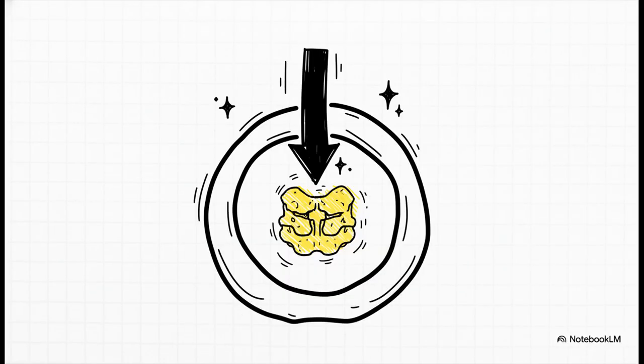So, the crucial point is this. When a radiographer executes the Townes method perfectly, aiming that 30-degree caudad beam right through the top of the head, the resulting image creates a very specific, visually striking indicator of success. The dorsum sellae and the posterior clinoid processes, these are tiny, deep structures of the sphenoid bone. They will be perfectly framed and visible right inside the large opening at the base of the skull, the foramen magnum. You are literally threading the needle with radiation.